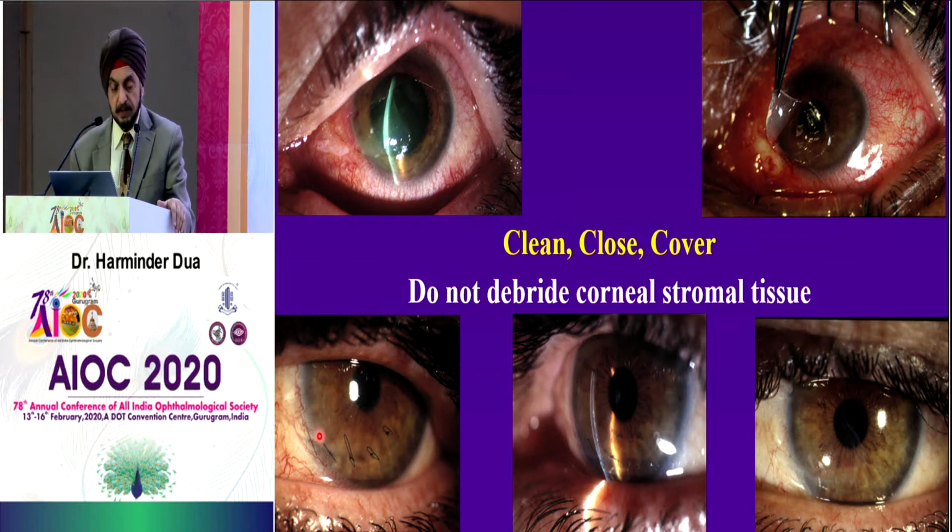You have to give tacking sutures. Now, these tacking sutures have no rules. You can just put them anywhere. They're very superficial sutures, but the important thing is that you have to align the extremity of the wound first. If that falls into place at the limbus, then the rest will fall into place, and it will have to be kept, like you can see over here, and then when all the sutures are removed, there is just a very faint line over there of the scar, but the rest has fallen into place.